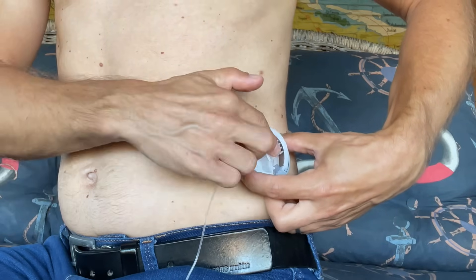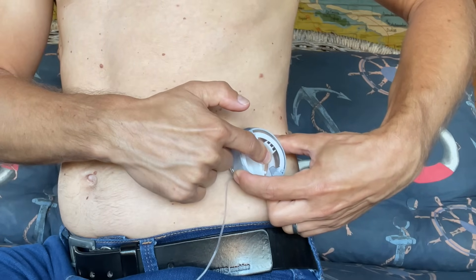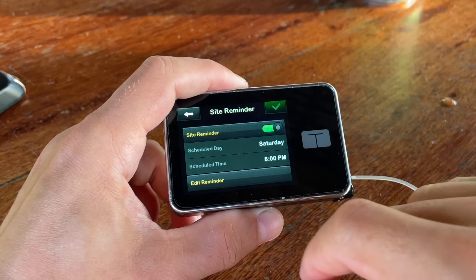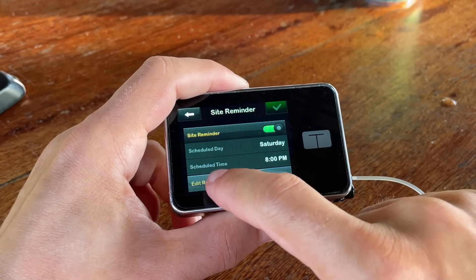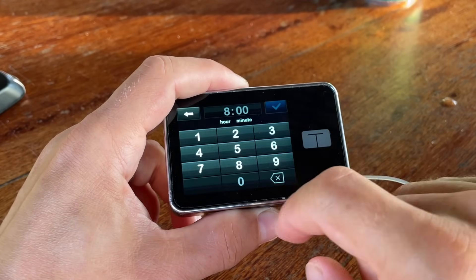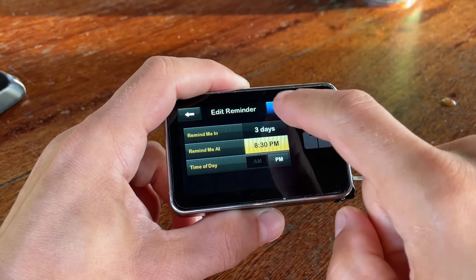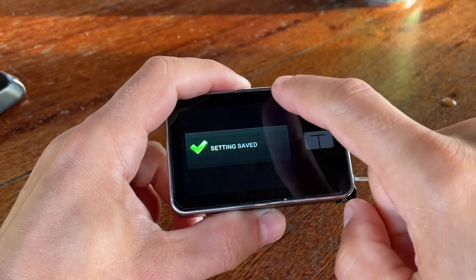Another really great feature of the T-Slim X2 is customized site change reminders. We all know we should change the infusion site at least every three days. With this pump you can set the reminder to a specific time within those three days — if you prefer 8:30 p.m., you can set it exactly to that time so you won't get any site change reminders in the middle of the night.